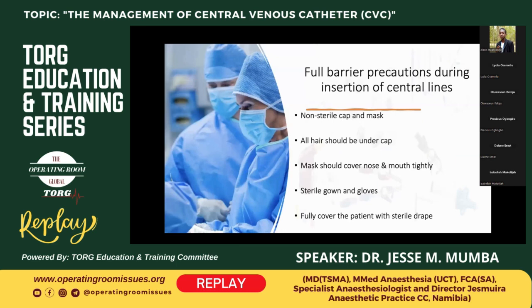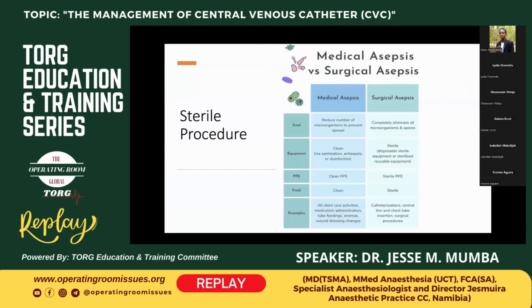Before insertion and before certain procedures that need to be done on a central line, we need to have the full barrier precaution. So this is where you don everything that gives that full barrier, from the cap and mask. You make sure that your hair is under the cap. You should wear that sterile gown appropriately with the gloves. And also you should have sterile drapes that cover the patient after you have cleaned the area of the central line. When we talk of cleaning, how do we do the cleaning?